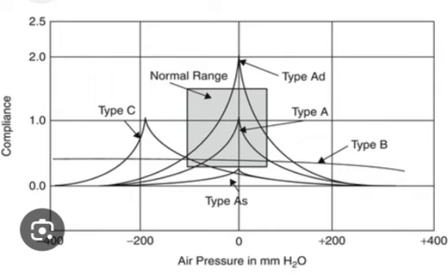Operation. A tone of 226 Hz is generated by a probe tip inserted into the external ear canal, where the sound strikes the tympanic membrane, causing vibration of the middle ear, which in turn results in the conscious perception of hearing. Some of this sound is reflected back and picked up by the instrument. Most middle ear problems result in stiffening of the middle ear, which causes more of the sound to be reflected back. While 226 Hz is the most common probe tone, others can be used.